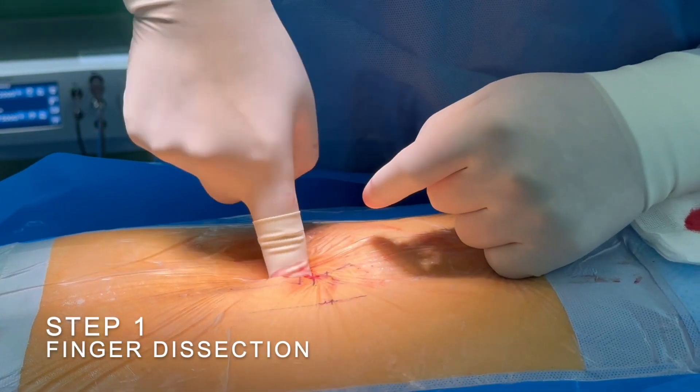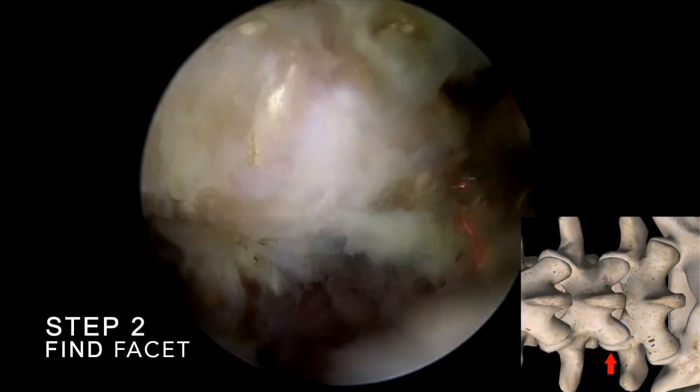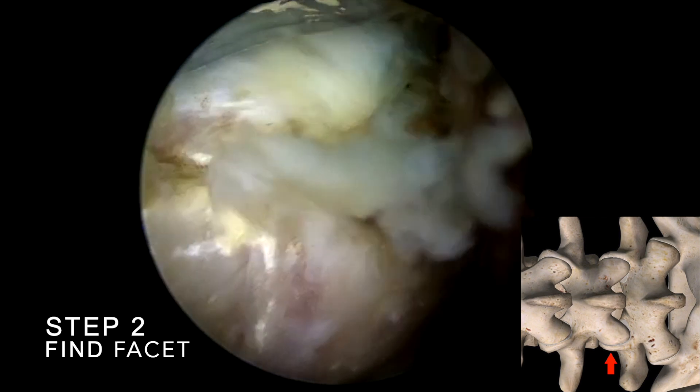Step 1: Use finger dissection to bluntly separate the muscle tissue over the facet. Step 2: Locate the facet and complete triangulation on it. Use the radiofrequency probe for dissection and tissue coagulation.